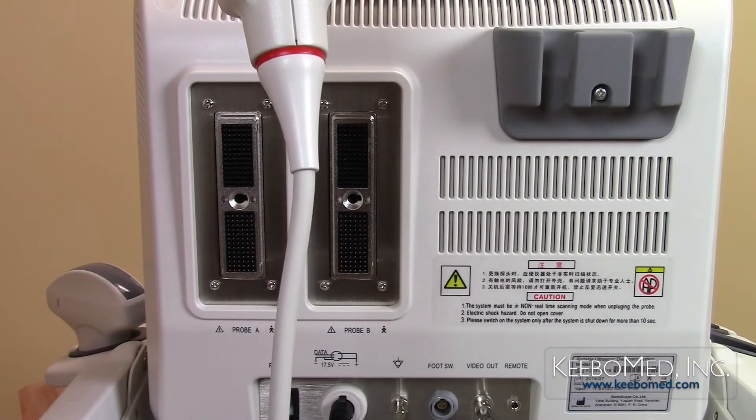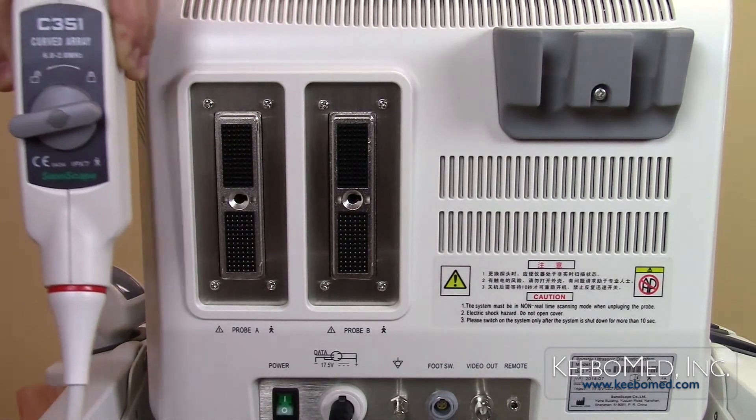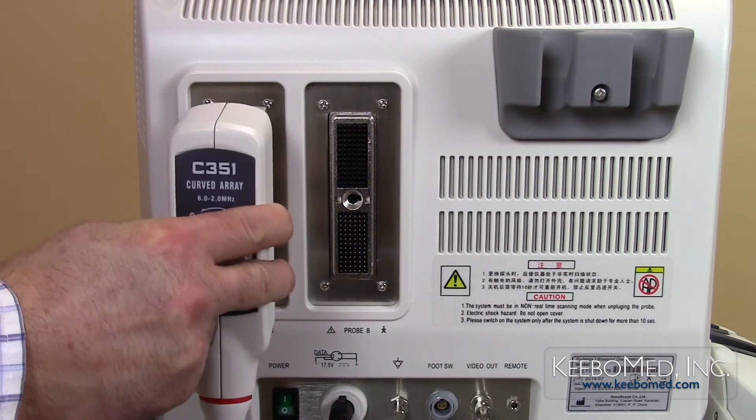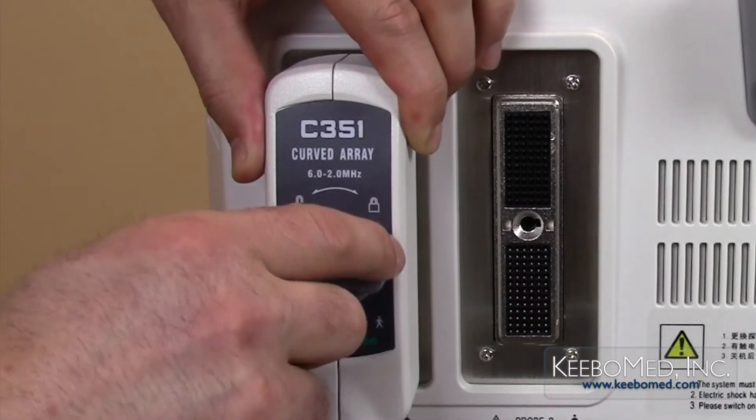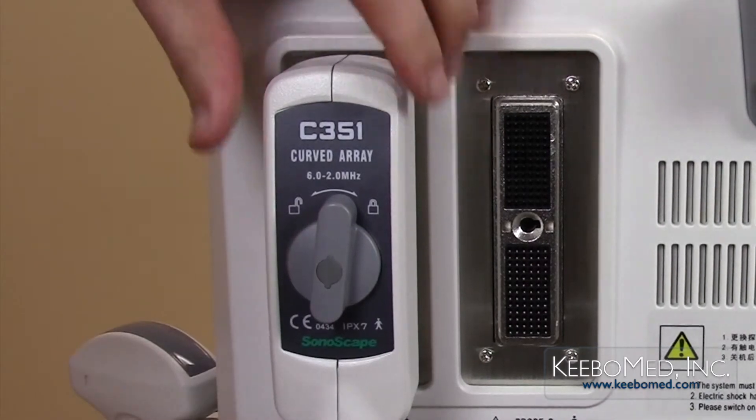Step 3. Make sure the probe cord is facing down and vertically insert the probe connector into the probe socket. Fold the connector and turn the lock knob clockwise to the locked position.